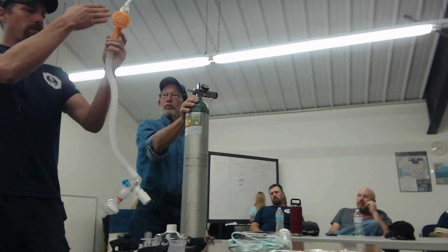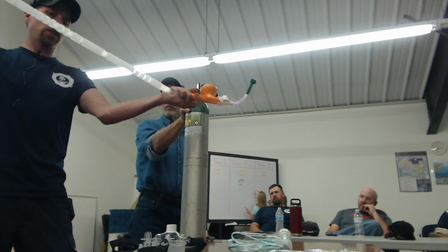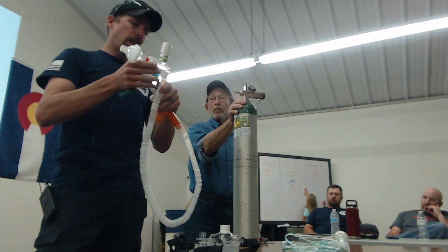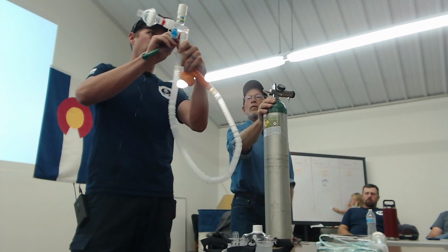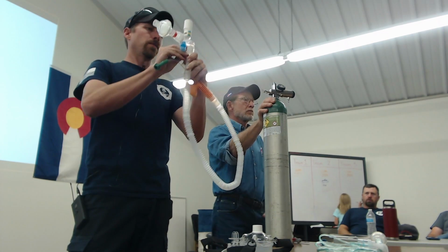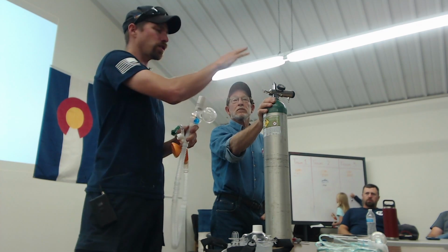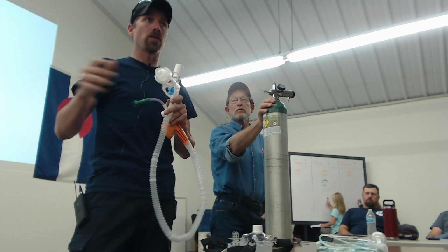So that 140 liters a minute travels through this tube. This tube can be expanded, worked around as necessary. Comes up into this. There is a little orange valve in here. This orange valve allows, say your oxygen bottle ran out and you weren't paying really close attention.